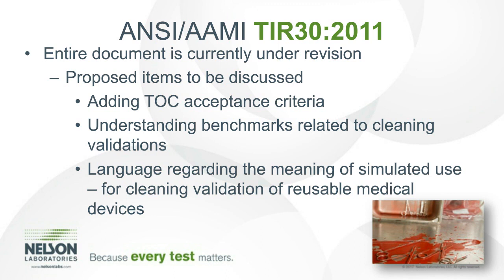And language regarding meaning of simulated use. There is a lot of uncertainty out there regarding what is simulated use. How are we supposed to perform these tests? What does it entail? How many cycles do I have to perform? Nothing is outlined in any standards at this point regarding that, but we are performing cleaning validations with simulated use testing. So this was a method for us to bring it into this standard and give guidance to the manufacturers to what the validation would contain.